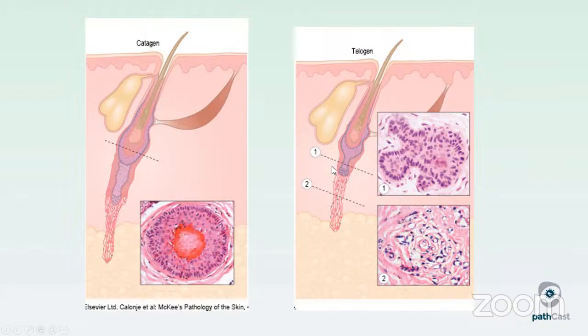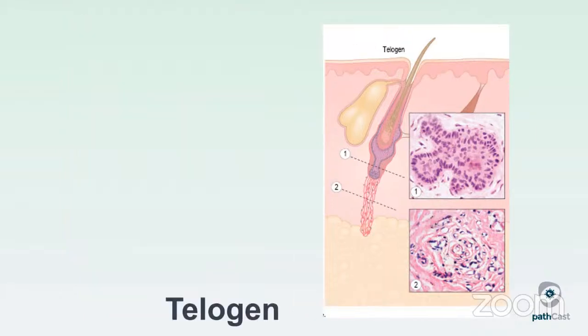When we are looking at the telogen hair in cross-section, below the telogen hair that's forming, I want to point out that there is this star-shaped, kind of asterisk-shaped structure that's dermal mesenchymal cells. This is the secondary hair germ that is going to induce formation of the new anagen hair that's going to take the place of the shedding hair and take root here. Beneath that is our fibrous tract remnant.